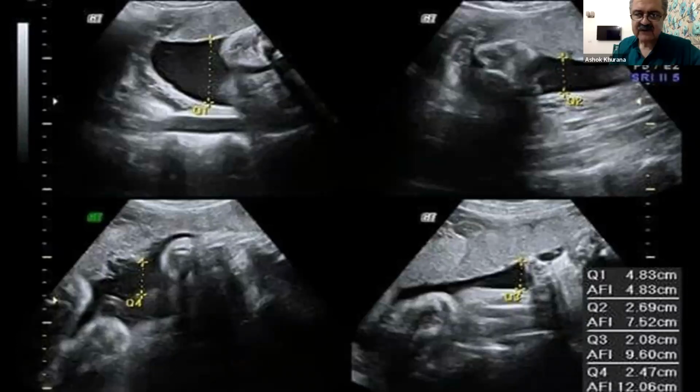So on the screen, on the laptops and on our phone screen, in the shared screen, we now have this excellent delineation of what the image should look like finally when we have computed the various 4 quadrants in the amniotic fluid index. And you've noticed that the measurements are done anterior to posterior in the 4 quadrants of the uterus, like it was emphasized, of the uterus and not of the maternal abdomen.